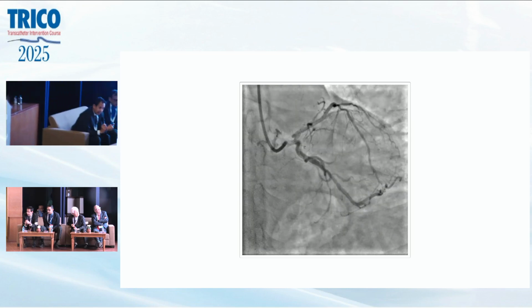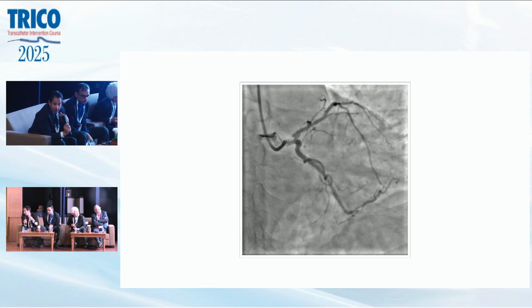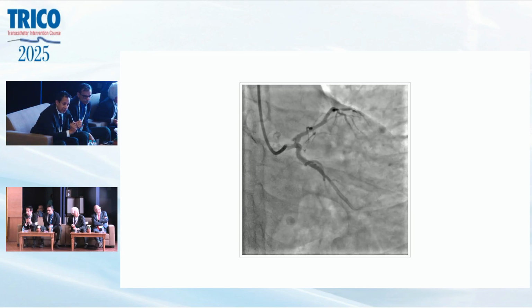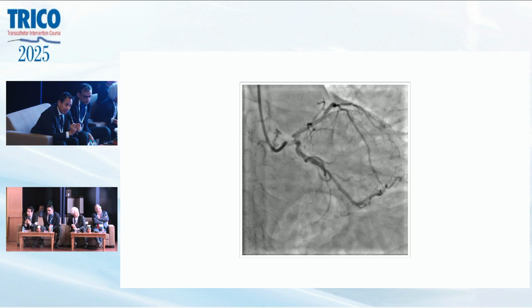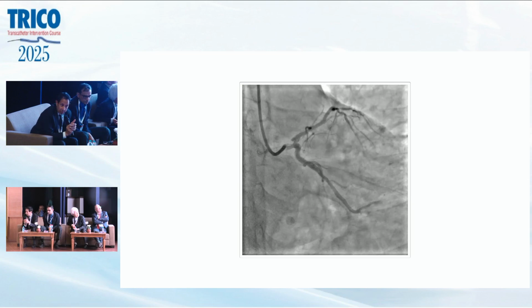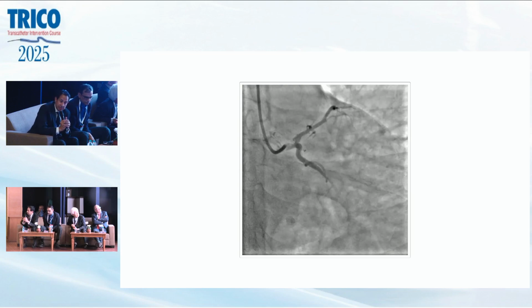Yeah, this looks like a very ugly acute lesion. Right now, just looking at the bifurcation itself, the circumflex origin looks spared, and based on the angiogram alone, I'm thinking it doesn't look calcified either, and one might think of a single stent approach, but here's where I would personally do IVUS to characterize this and understand it.